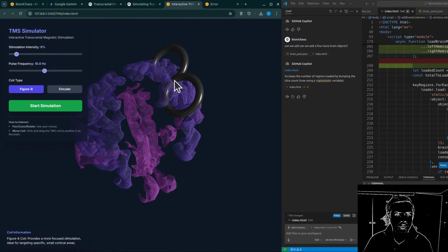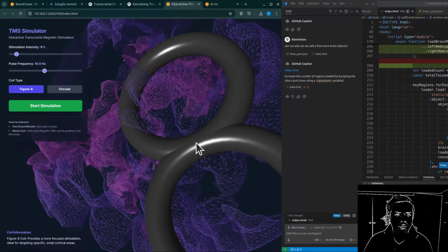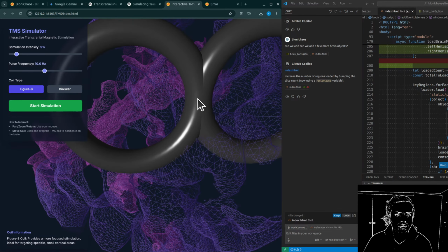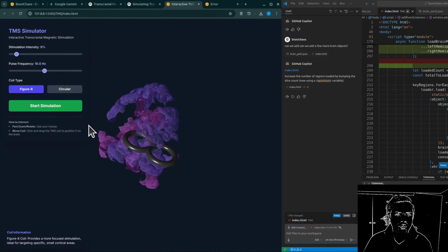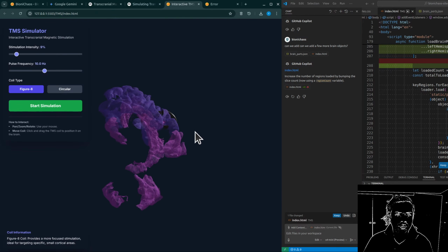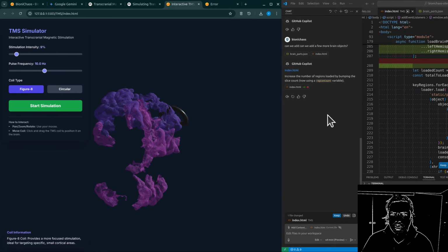Okay, so zooming out a bit. Right. These simulations explore the kind of broader impact of TMS. They ask questions like, how does stimulating one specific target area influence the activity of brain regions that are far away but connected through white matter tracts? Ah, the downstream effect. Exactly. Or how do different TMS protocols, like the frequency or pattern of the pulses, affect the overall network dynamics, or even processes like synaptic plasticity? Plasticity. Yeah. The brain changing its connections. Which is fundamental for things like learning, memory, and potentially therapeutic effects, too.